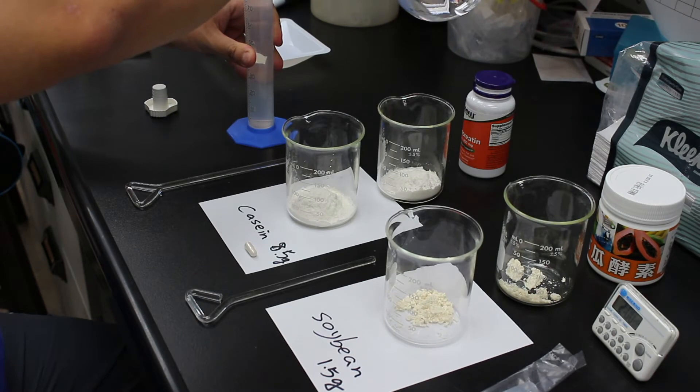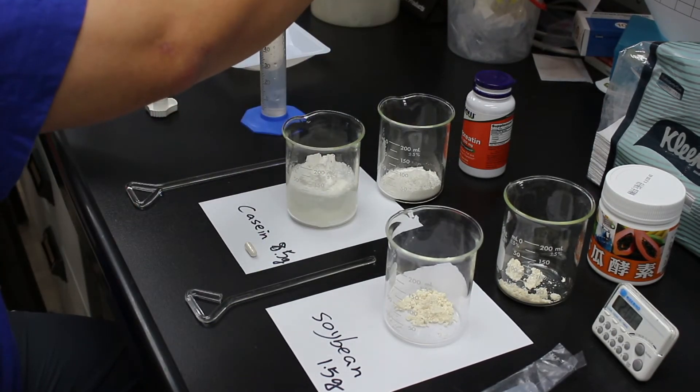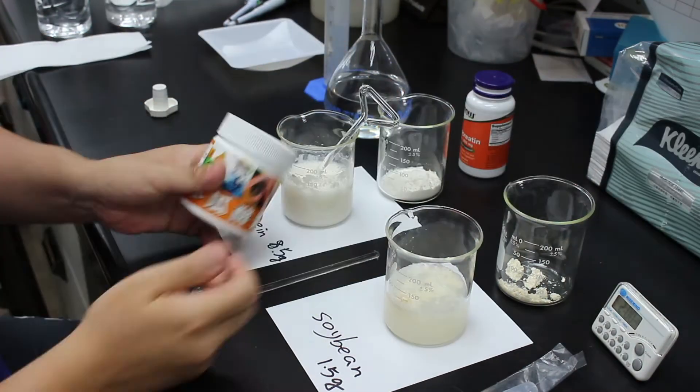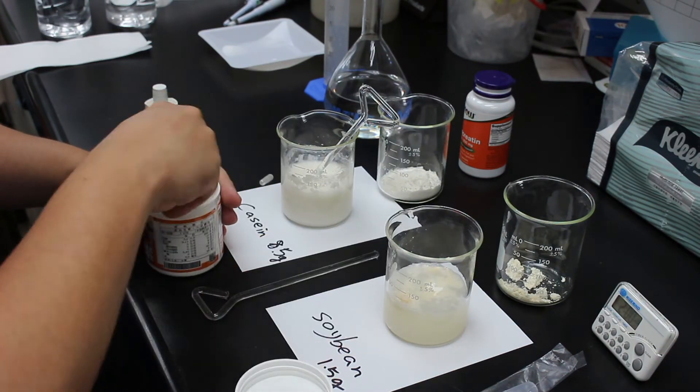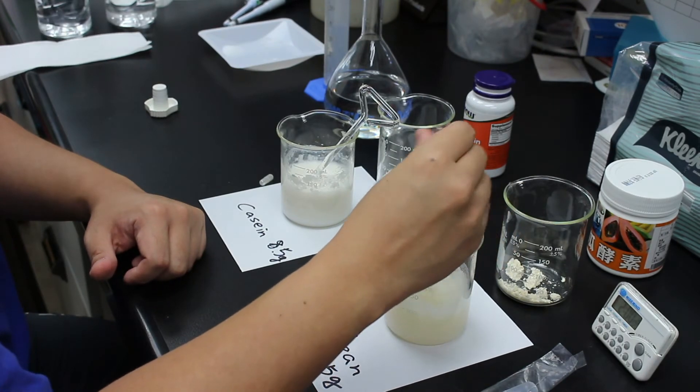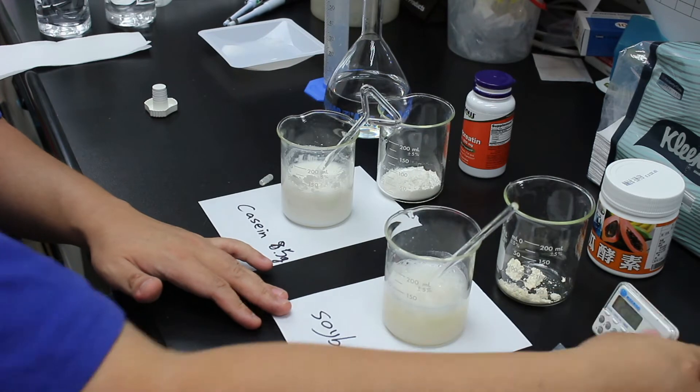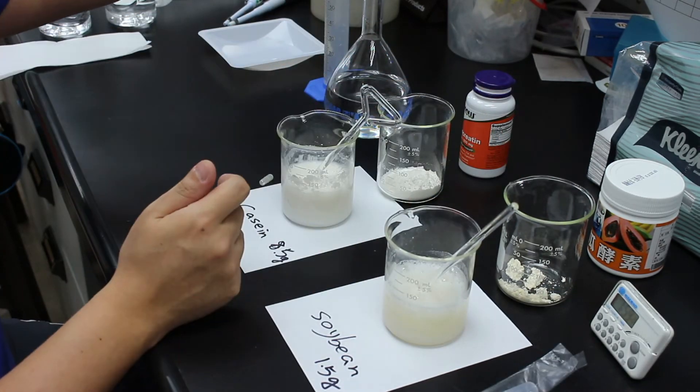First I add 100ml of water to casein and soybean and mix them up, then I add enzyme into each of them. I have 2 beakers here because I plan to try 2 different digest times, 2 hours and 4 hours, and compare them at the end. After adding the enzyme, I adjust the pH value to around 8 and let it react.